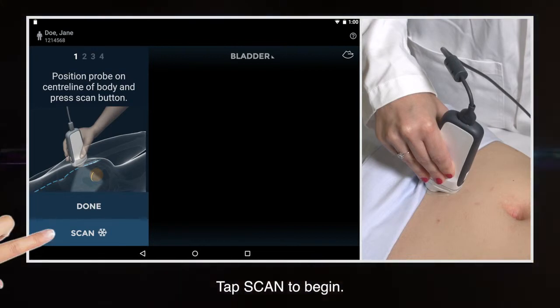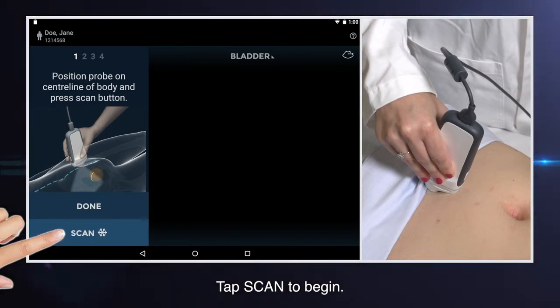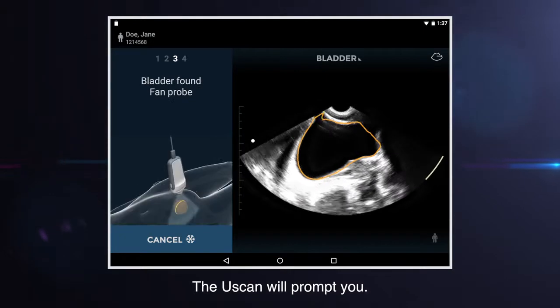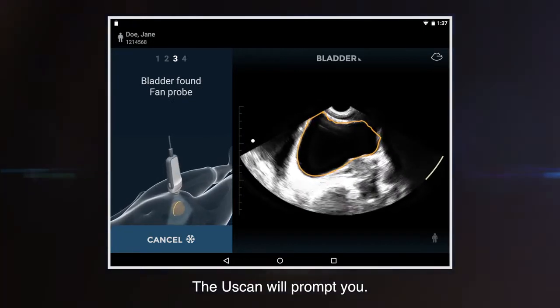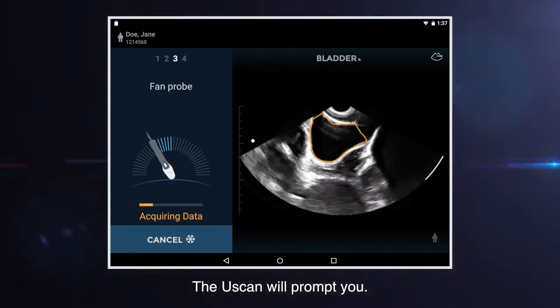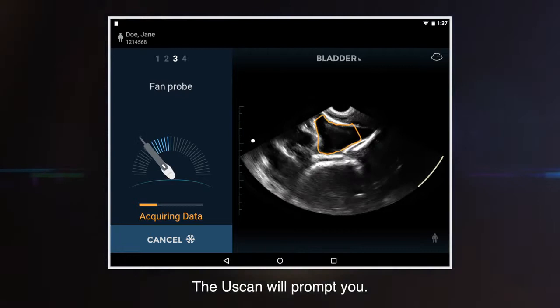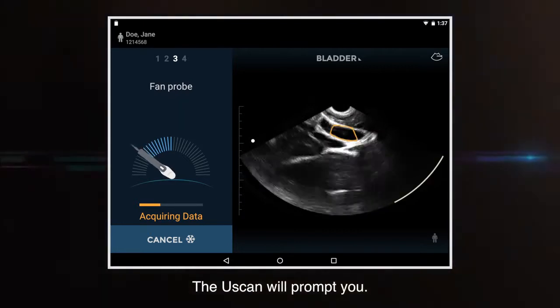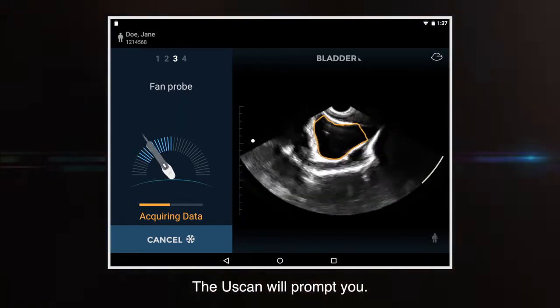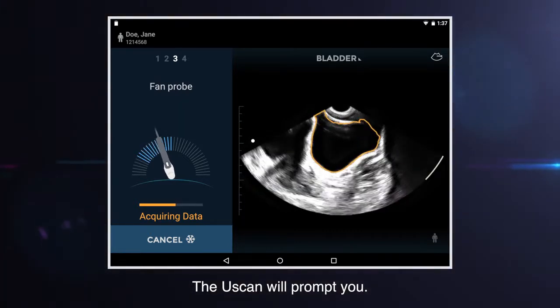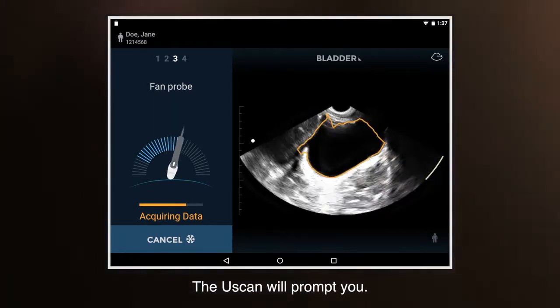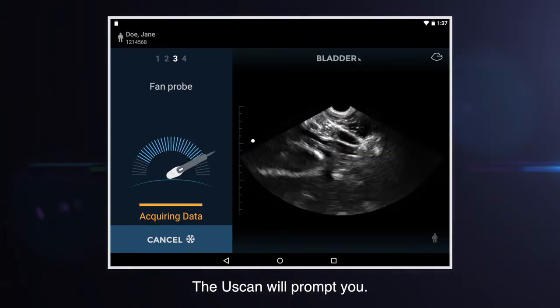Tap scan on the display to begin scanning. When the probe is in the correct position, the user will be prompted to angle the probe from one side and then to the other to acquire bladder data using Cygnostics' unique uSlice technology, which acquires dozens of slices through the bladder for accurate measurement.